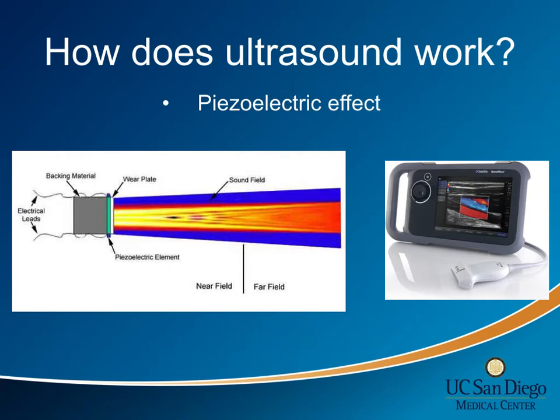When it comes to the technological application of ultrasound, we rely on the piezoelectric effect. Here, an electric current is applied to a set of crystals within the transducer, causing vibration. The vibration of the crystals produces sound waves that travel outward. Conversely, when sound or pressure waves return back and hit the crystals, they vibrate again, resulting in an electrical current that the machine is able to interpret into a visual representation on the screen.